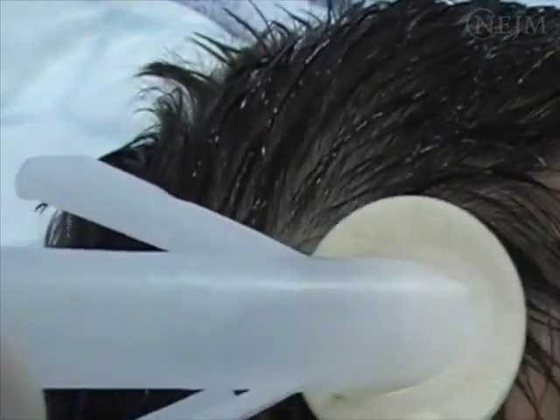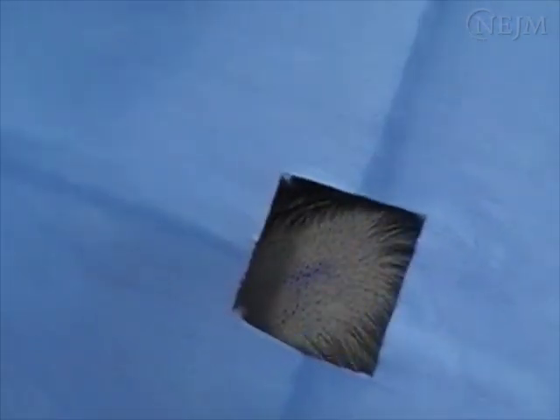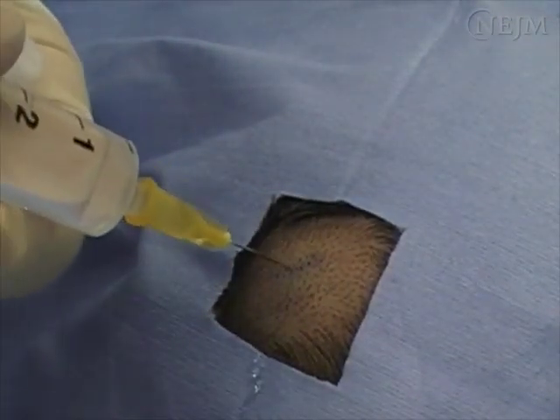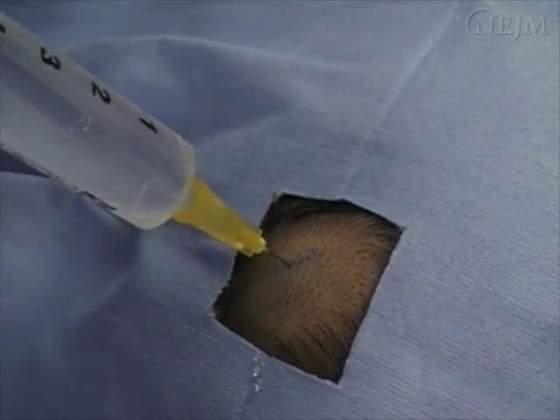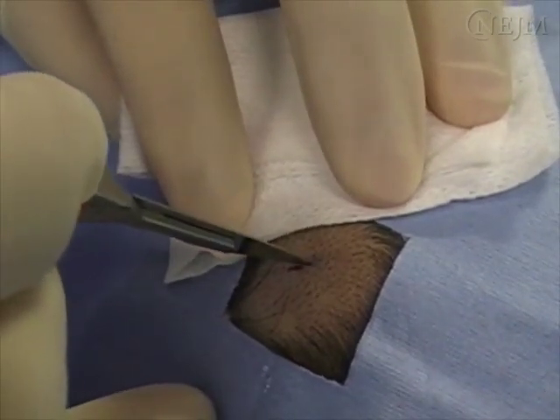Wipe the frontal area three times from the centre to the periphery with an antiseptic solution. Then place a sterile fenestrated drape over the head. Larger sterile drapes may also be used, but follow local guidelines. Raise a bleb with local anaesthetic. Make a short 5mm linear stab incision. Use of a retractor is usually unnecessary.